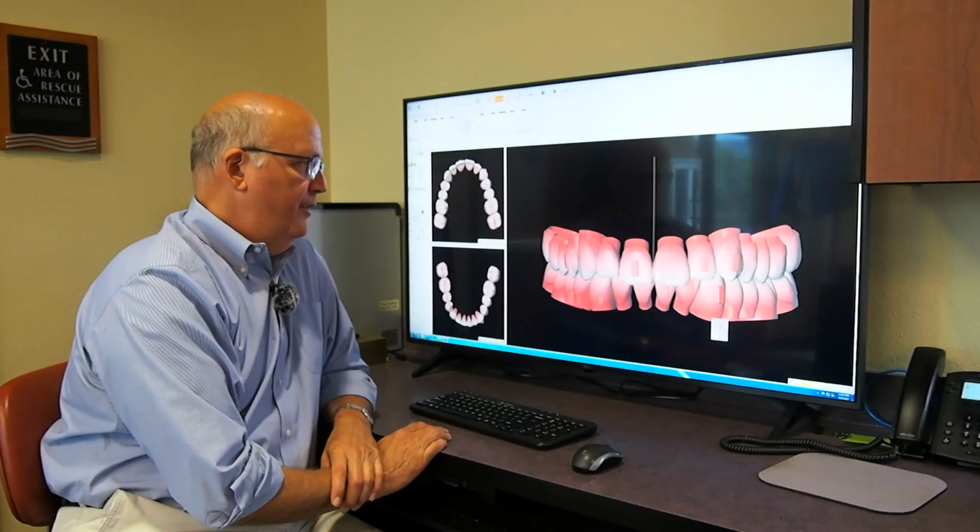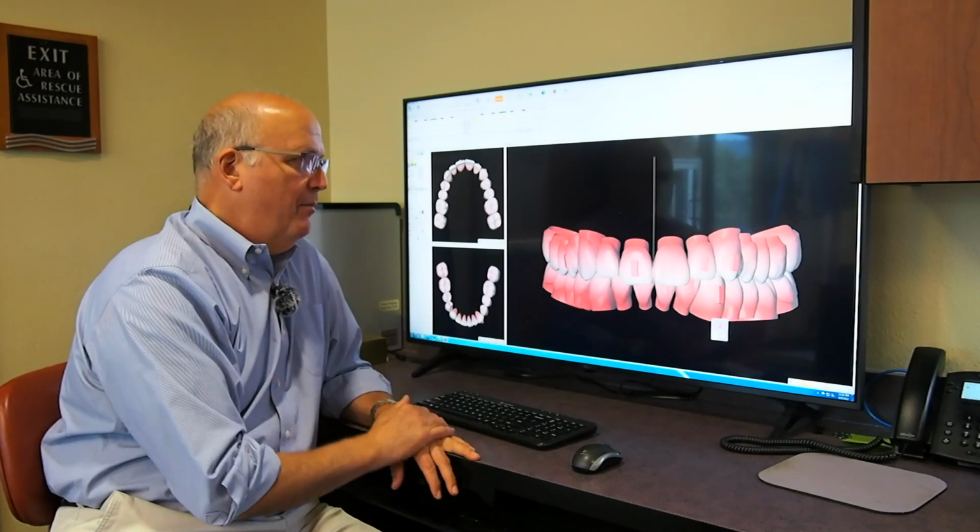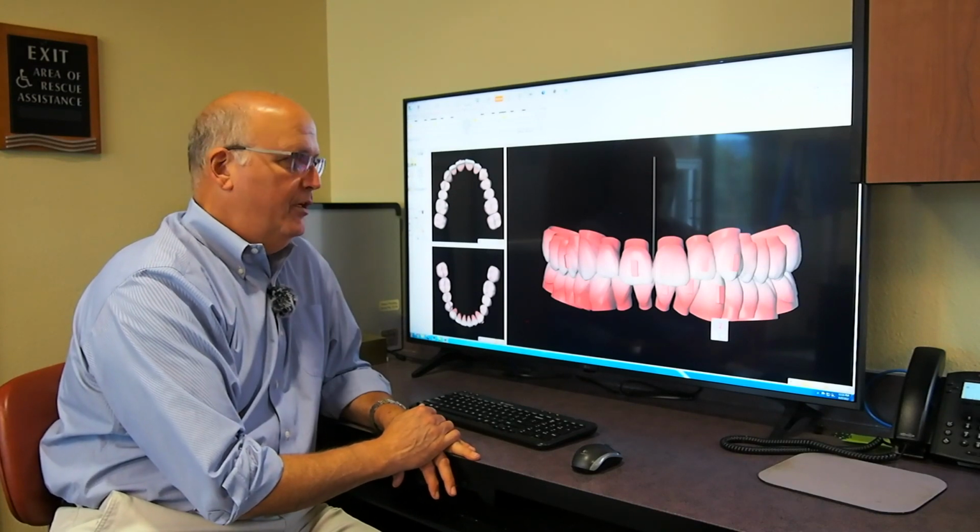It utilizes sophisticated white light scanning that will create thousands of photographs with topographical information that is knit together to then make a file of the topography of the teeth. This is an example of teeth that have been electronically rendered into a map for a patient.